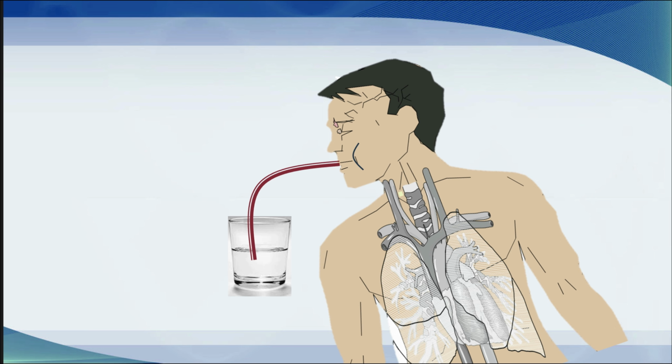It's very easy to blow air out through a straw into a liquid, and it bubbles, and you can see the air just bubbling up and passing out of the liquid. When you want to suck in, you need to generate a fair amount of pressure within your mouth to get the liquid to move up into your mouth. But you cannot pull air in because the liquid stops the air from going into the straw. And that's how chest tubes work in this setting.